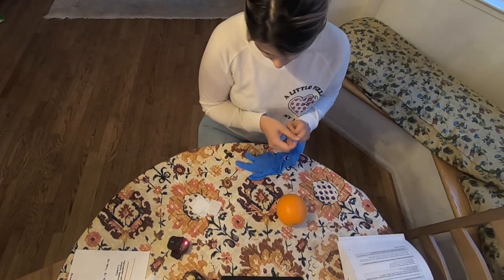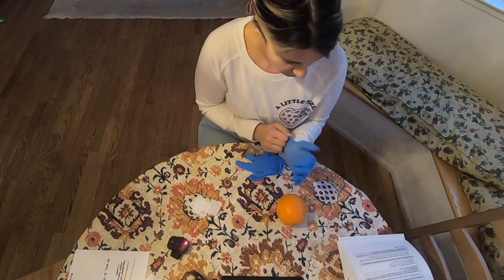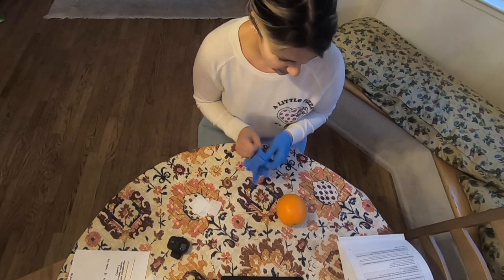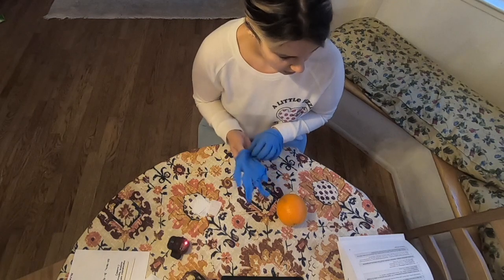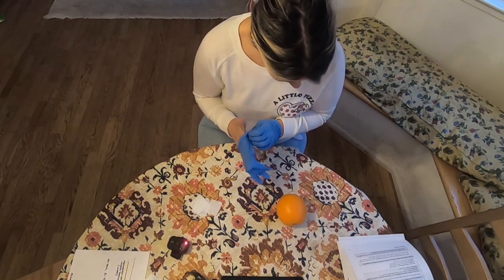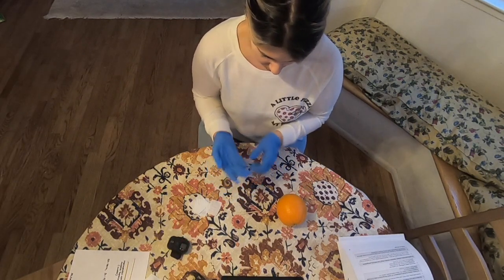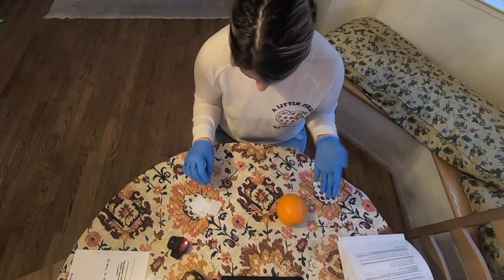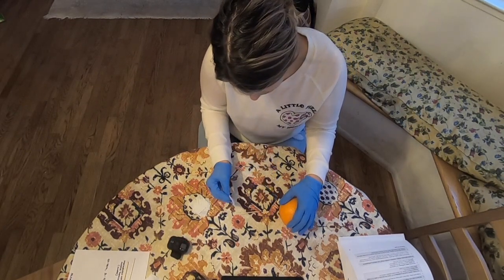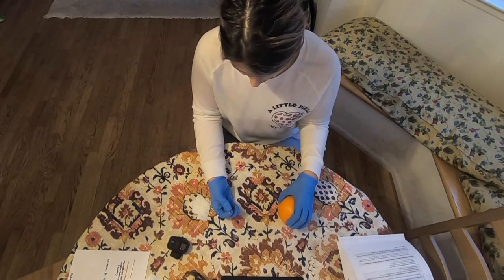We have three sites to select from: the ventrogluteal, which can hold up to 3ml; the vastus lateralis, which can also hold 3ml; and the deltoid. We're going to use the gluteal area today using the Z-Track method. I'm putting on my gloves. I'll take an alcohol wipe and clean the area. Once that dries, we'll pull the skin back about 2.5 centimeters to perform the Z-Track.